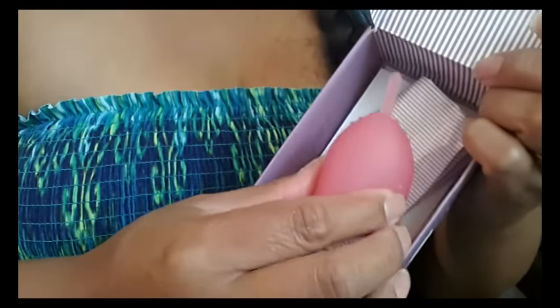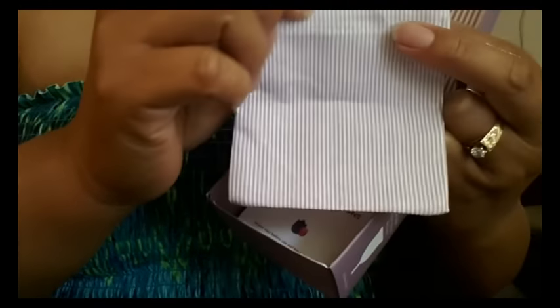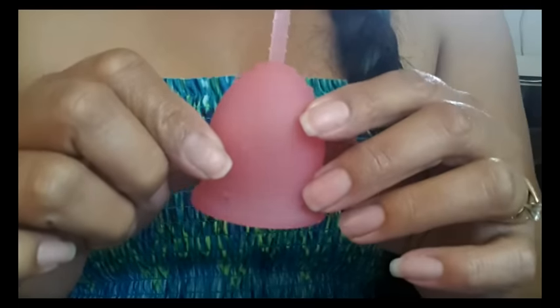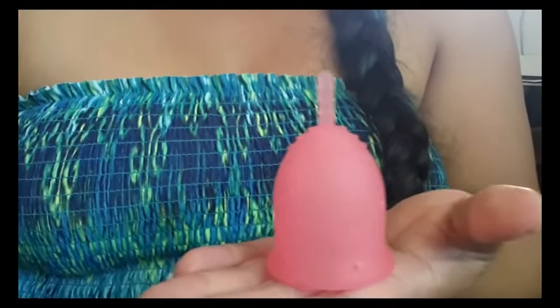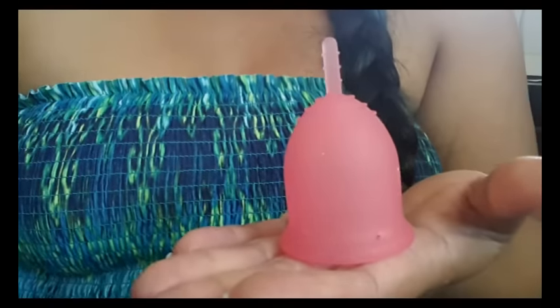The littlest things make me happy. Here's the cup and it comes with a purple and white drawstring pouch — it's a one-sided drawstring — and a pamphlet. This is the Lena cup and again it is this pink color. It's very close to the Sabelle color pink if you have that.